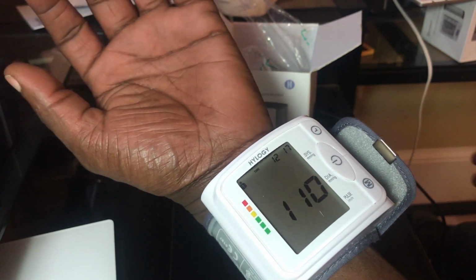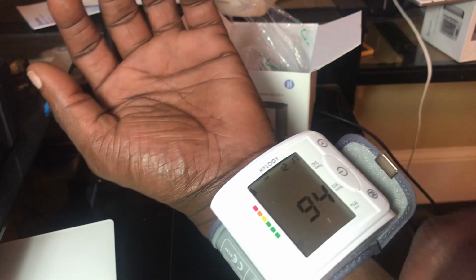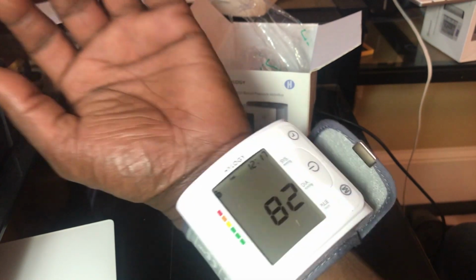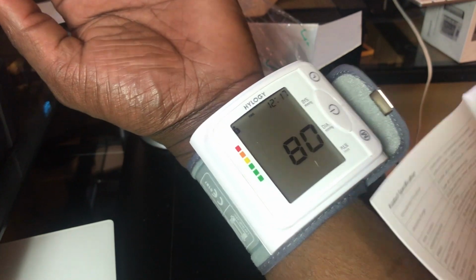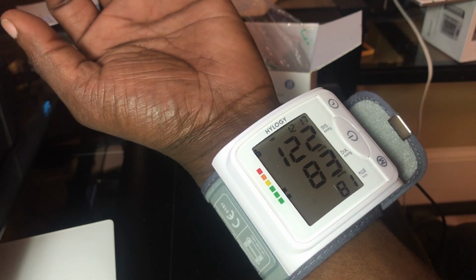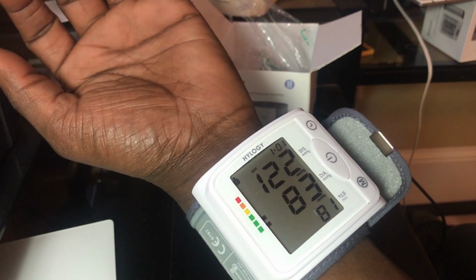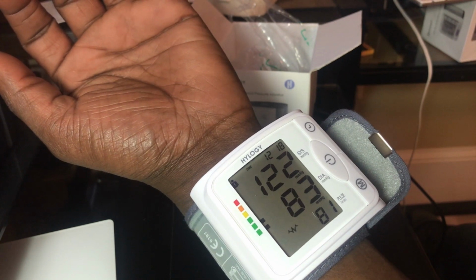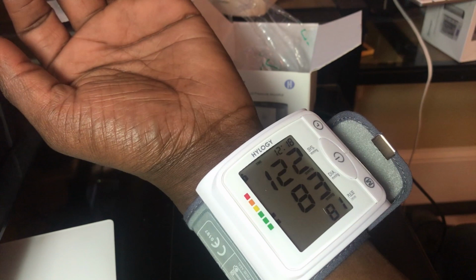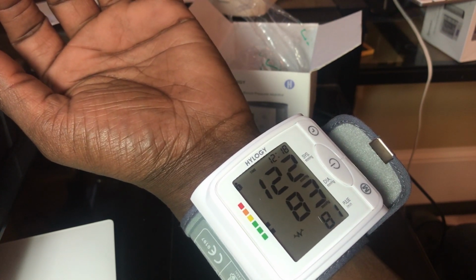So it's not heavy at all, and while it's doing its reading, I'm just gonna give you the dimensions, which you can find in the manual. But since we're on camera now, we might as well do that. So the dimensions are 13.5 to 21 centimeters. So it's a pretty small gadget, and the visible screen is 43.8 by 34 millimeters.